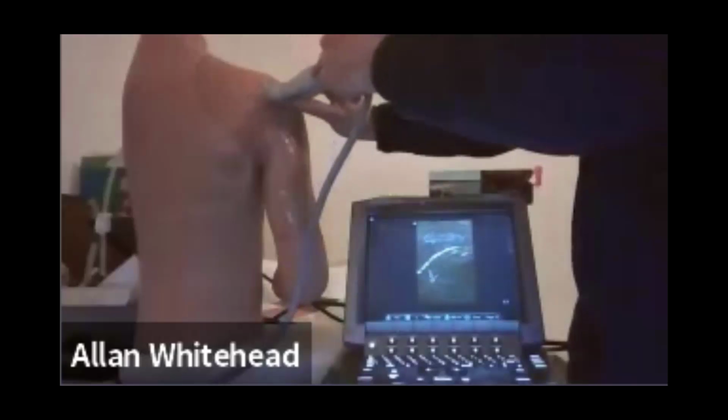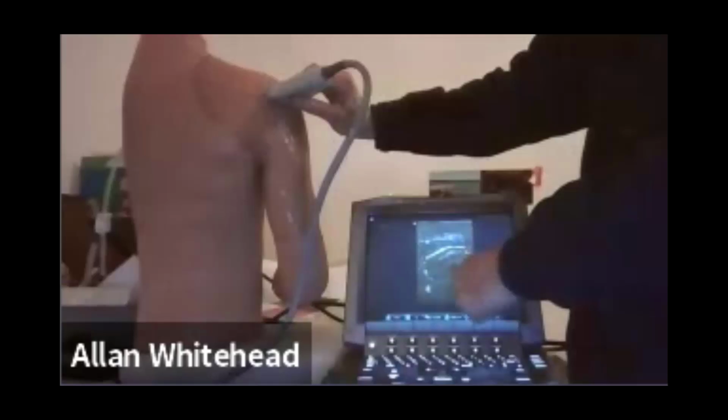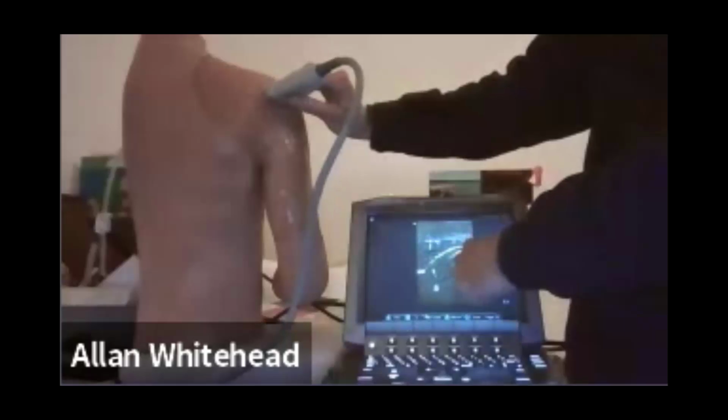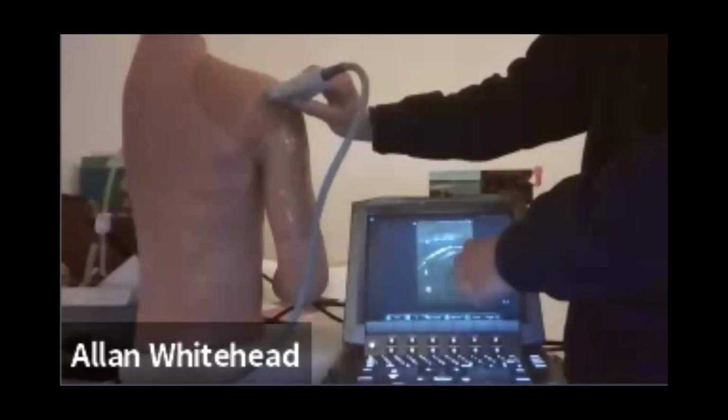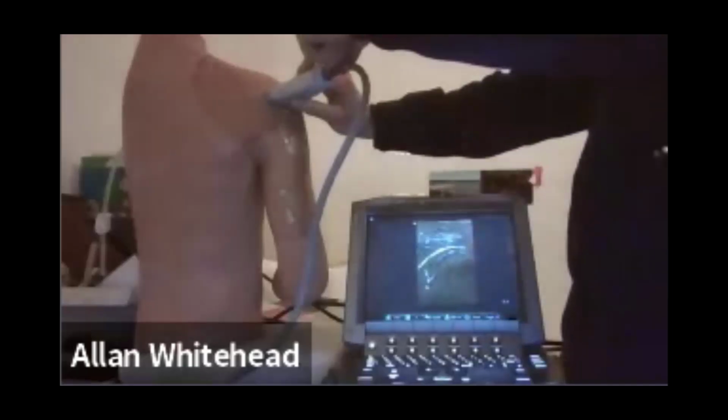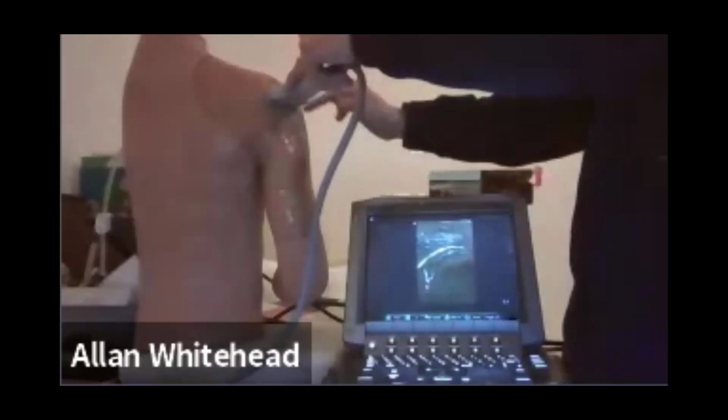But normally if it was a dislocation and the head's down here, I've got all this space to aim for. So you don't have to be that precise. You just got to estimate where you think the center of the head would have been normally and aim for that spot. So I would have it here in the middle of the screen. There's the center of the head. I'd want to be aiming 3, maybe 3.5 to 4 centimeters in, same direction as the beam. I'm pointing the beam.